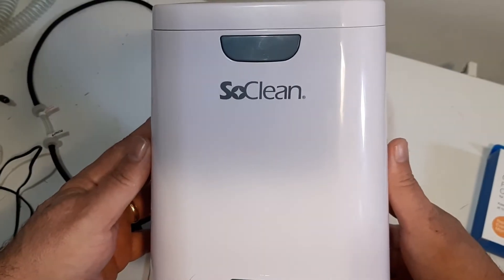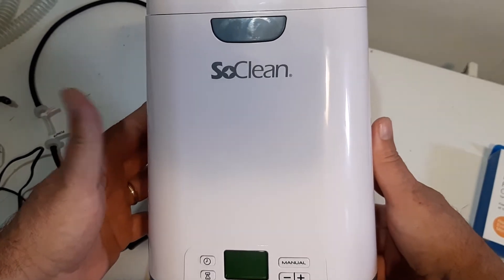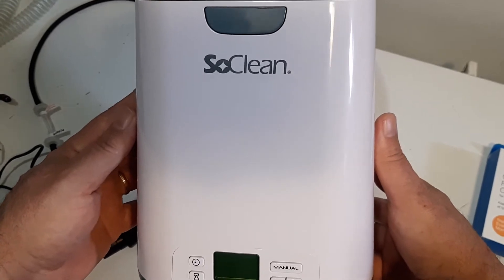Hey, my name is Jim McLaren. Today is Tuesday, April the 2nd, 2019. Today I'm going to look at this SoClean — it's a disinfecting device for your CPAP machine.